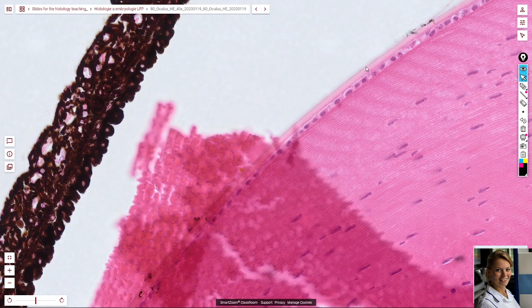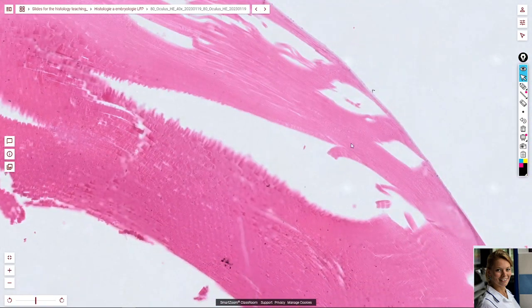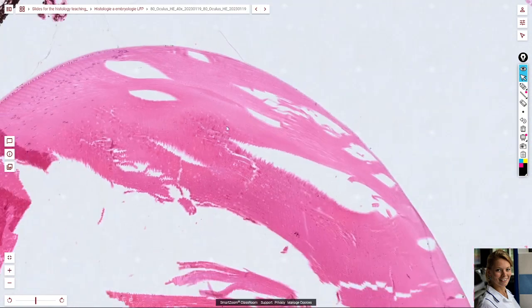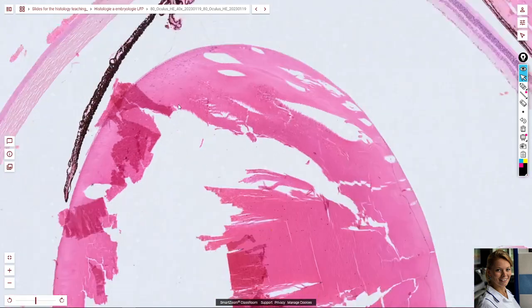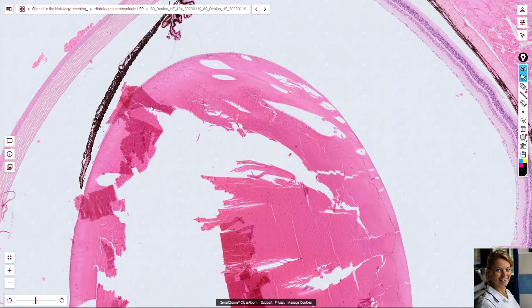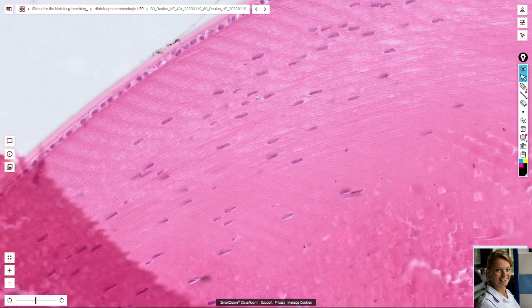matrix. Beneath the capsule is an epithelium of lens, one layer of cuboidal cells, but only on the anterior surface here, but not on the posterior surface of lens. Substance of lens contains the cortex and the nucleus of lens. Cortex of lens contains very elongated concentric hexagonal eosinophilic cells with nucleus and organelles.